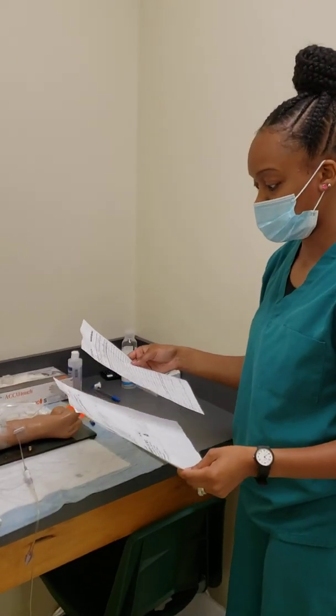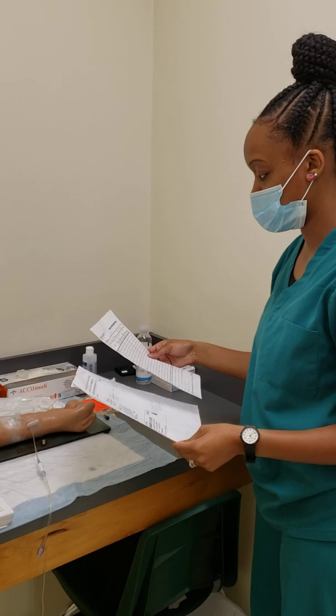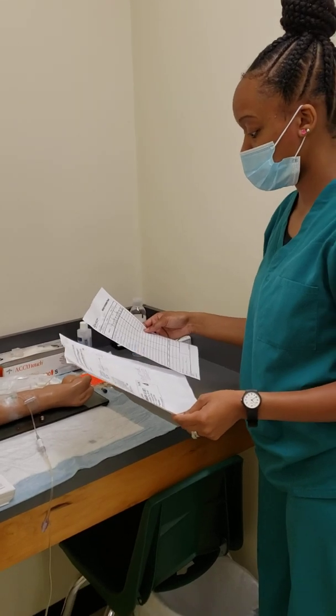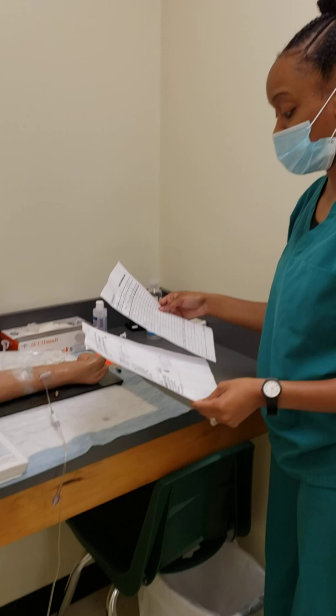Good morning. I have my physician's order here and I have my MAR. My patient is Demetrius Davis. Her date of birth is 4/11/95 and she has no known allergies. She's in room 303. She's going to be getting gentamicin, IVPB every 8 hours.